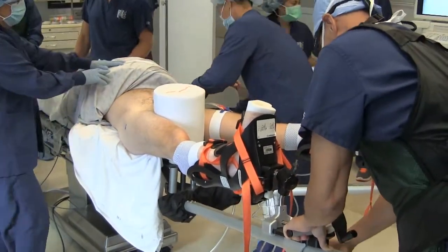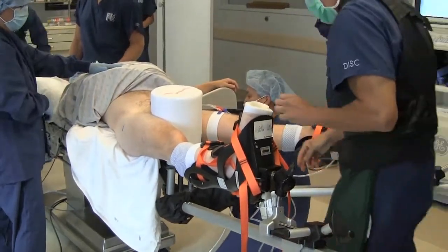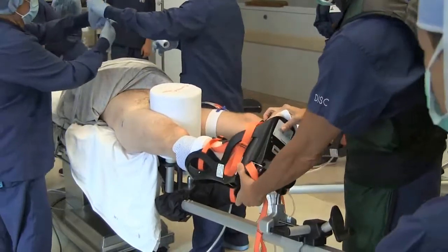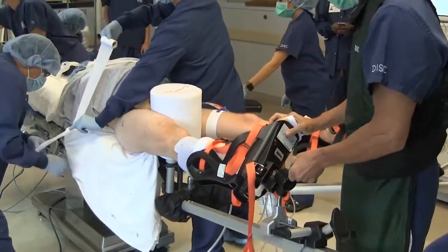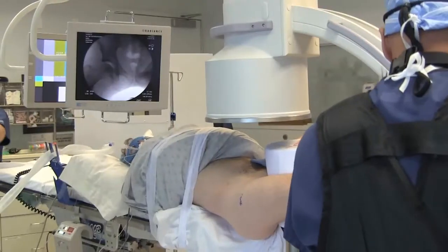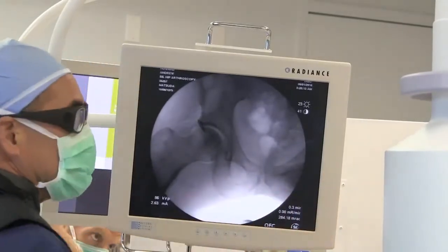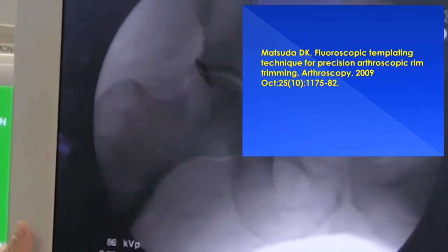In this case, the right hip is the first operative hip. The post is lateralized towards that hip, and the left lower extremity is placed in an abducted position for counter traction. The right lower extremity is placed in 10 degrees flexion, 20 degrees abduction, and moderate internal rotation. The C-arm is positioned between the legs rather than coming from the contralateral side. The fluoroscopic template is drawn on the floating monitor screen with an erasable marking pen.